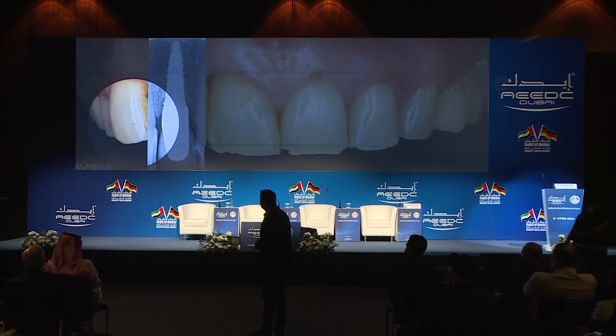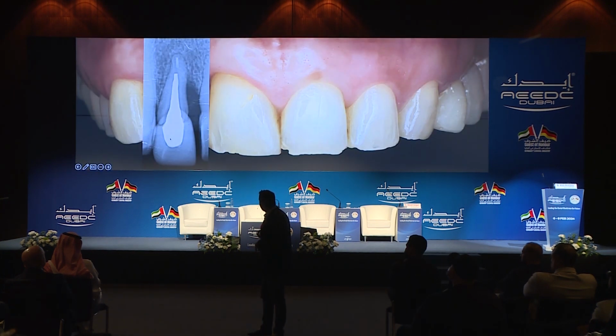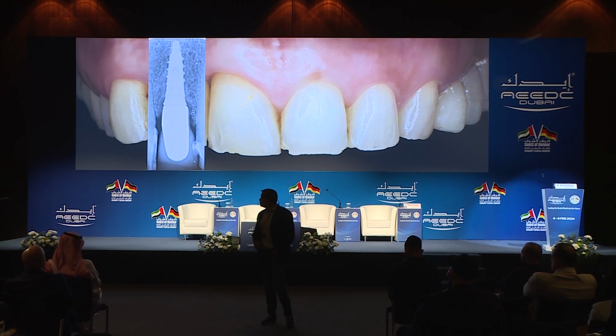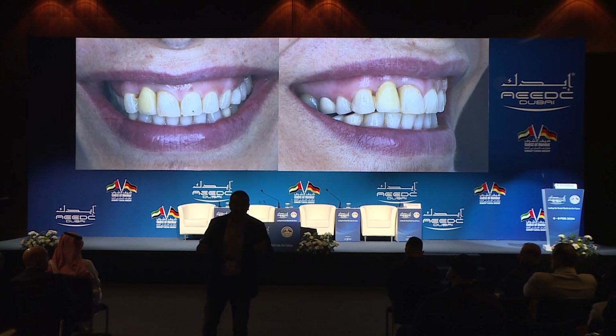And the reason why you have no bone is that she lost the bone in the first place. So we have to create bone first on the interproximal to support the papilla, otherwise we're going to end up with a short papilla. So I said, let's try to save this case, even though I think we should remove it. Once you open up a flap, the other good news was she has a gummy smile, so you can play a little bit, bringing the tissue down from here, up from there, so maybe we can show an illusion of a good aesthetic outcome.